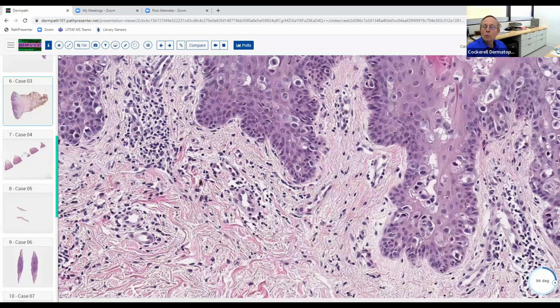That's an interesting question that you raised, because what kind of mucin is produced by these cells versus mucin that's produced by these cells? I think it's glycogen for, well, it actually does produce a mucin. I don't know.